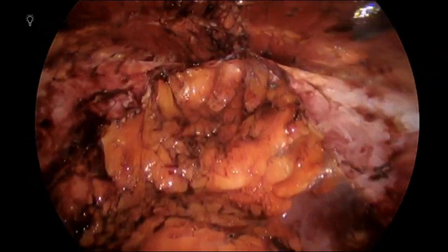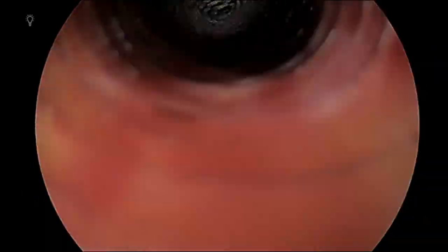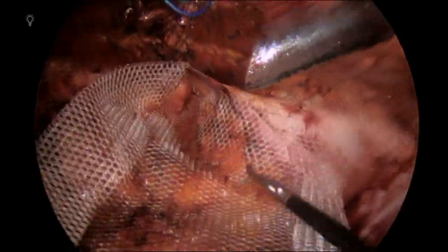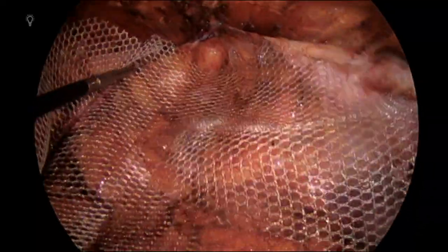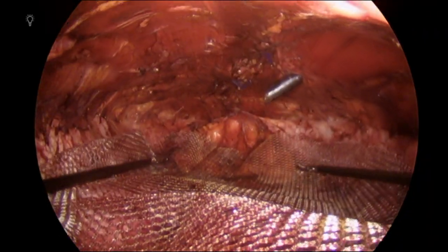And I will introduce a mesh of 30 by 20. I usually do not put any fixation method when I do these surgeries. And if I do not perform a TAR, I will not use a drain.